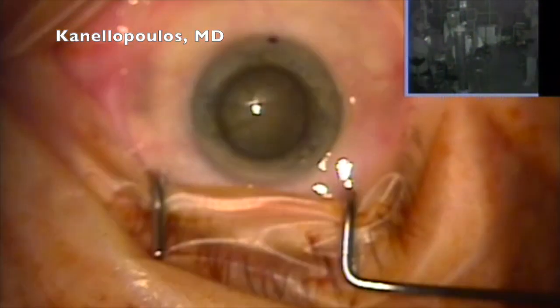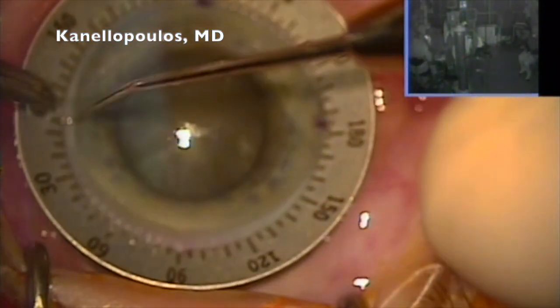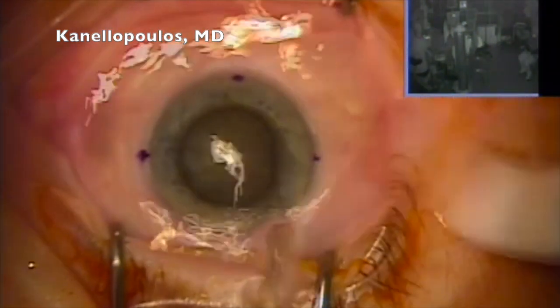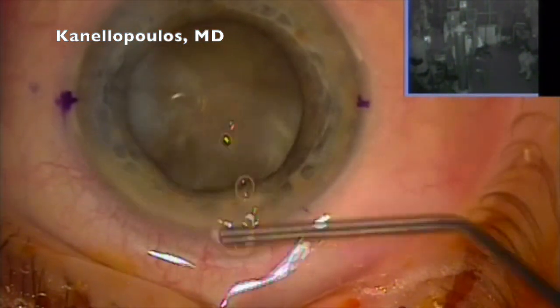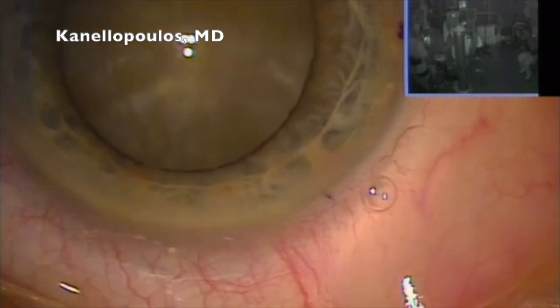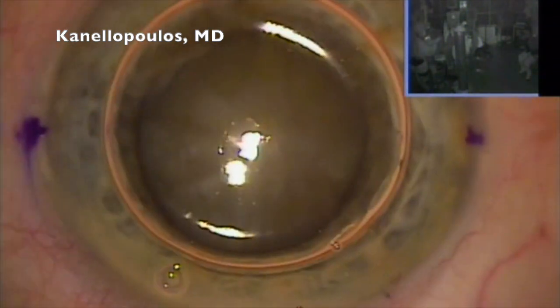cases from our office. All right, challenging. 80-something-year-old lady. Obviously, she took her time to have her procedures done. She's count fingers. We've tried an image of the macula. There seems to be no macular problem. She has significant astigmatism. I'm very careful here. Very small incision initially.